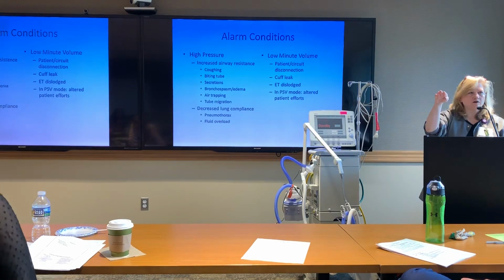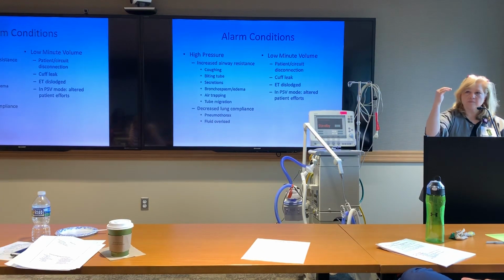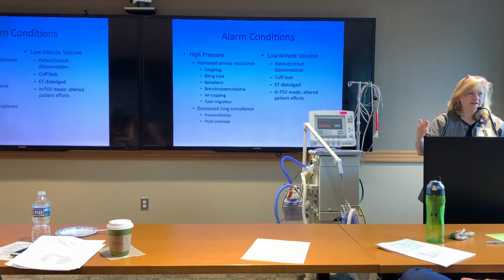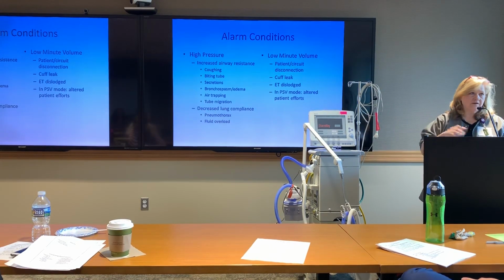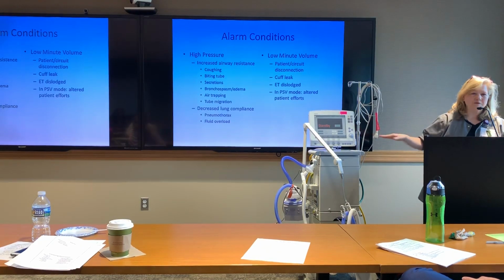But if you're seeing that alarm, that just means I'm getting within the maximum operating range. I can't go any higher than this unless you come and fix this. You either change my limits or you fix the patient, one or the other. But it's just letting you know I'm really not going to be able to maintain that tidal volume goal you want me to do. So that's what that is.